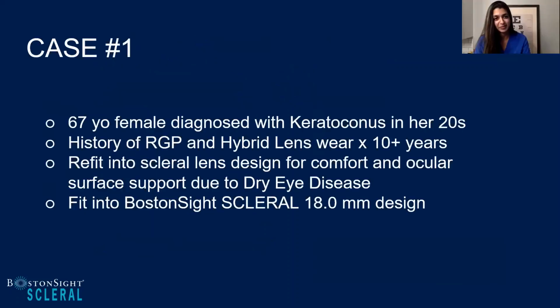Yes, absolutely. I think this first case is of a 67-year-old female that wore many different types of lenses. She was diagnosed with keratoconus since her 20s. And I met her because she was very motivated to be refit into, or to be fit into scleral lenses for the purpose of her dry eye disease.